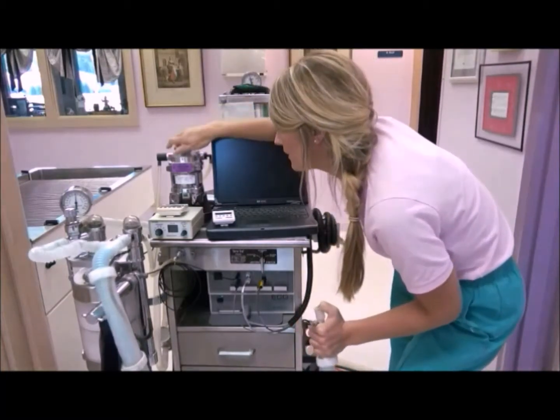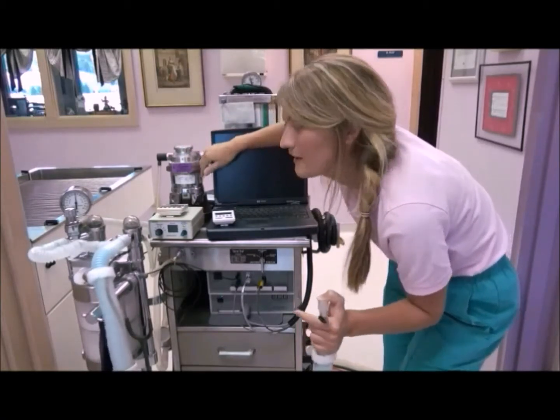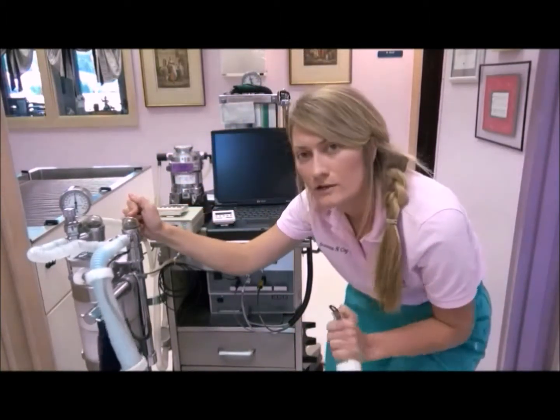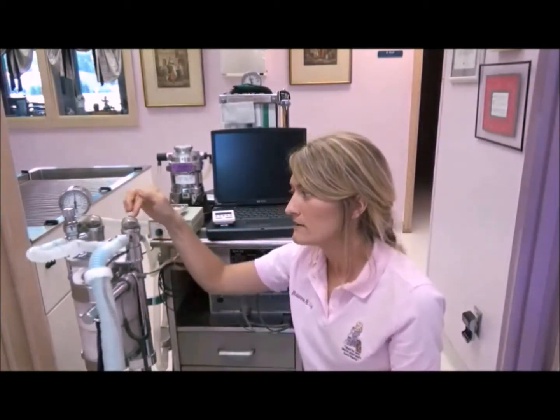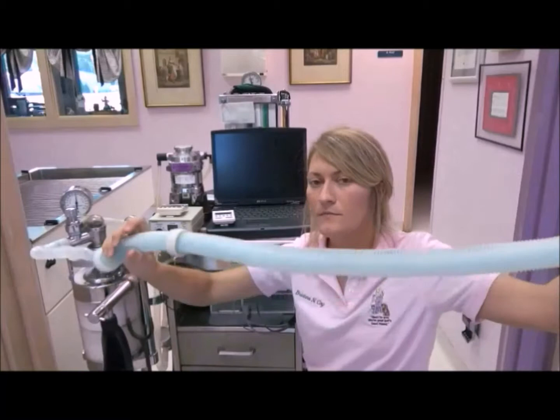So from there, the oxygen and inhalant anesthetic travels, making its way towards the patient through this outlet line here, and then it makes its way to the inspiratory unidirectional valve. So this will work whenever the patient inhales. It allows this to open up, and the anesthetic oxygen mix travels through the rebreathing tube to the patient.